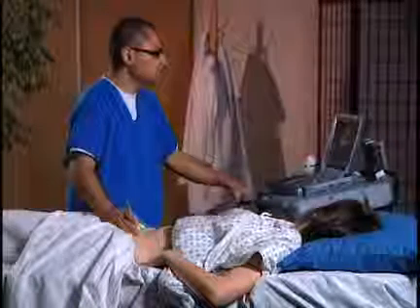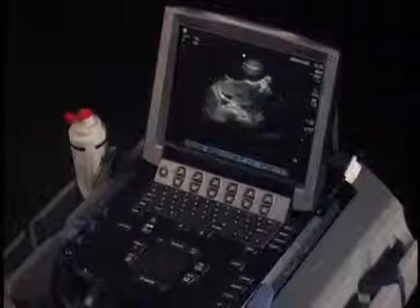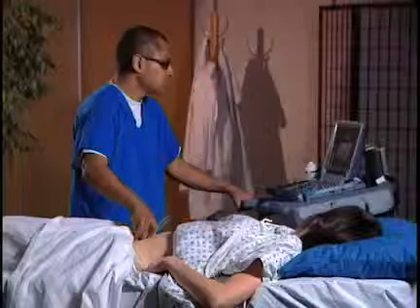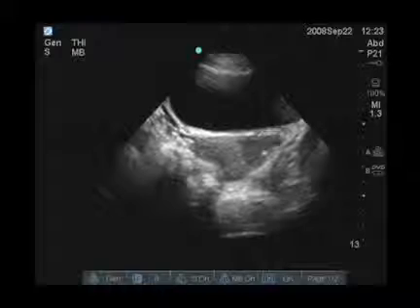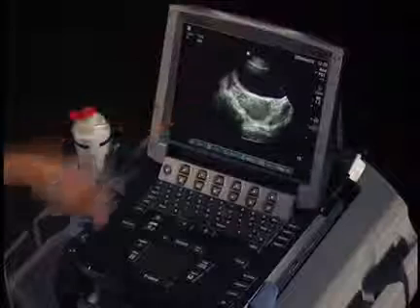In between, we're also going to identify the uterus. We're going right to the very top of the bladder, to about mid-bladder. We can see the uterus here in the center. There's a very small amount of free fluid here, which can be physiological as well. We're scanning all the way inferiorly, then through more superiorly we see the uterus. We actually see part of the ovary there, and then we're going to go all the way more superiorly.